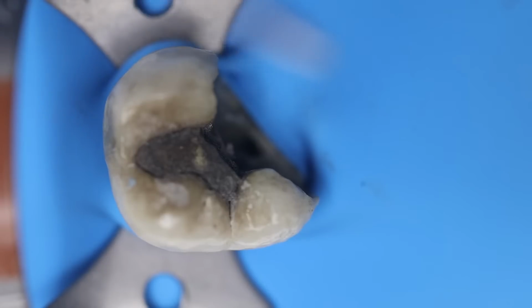So, beginning with this access opening, you can easily visualize that this is a molar with a dislodged restoration that was previously done, and a dislodged tooth structure that was cariously destructed. Okay, and an orifice that can be seen over here. So a complicated tooth is this, and we will begin with access opening.